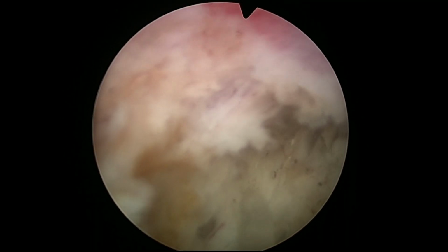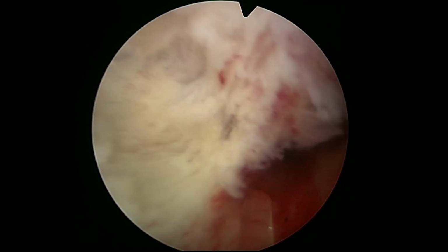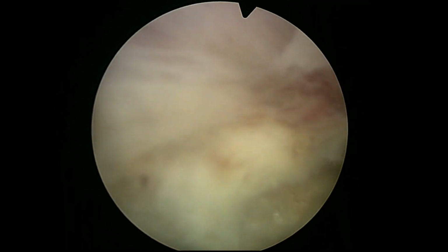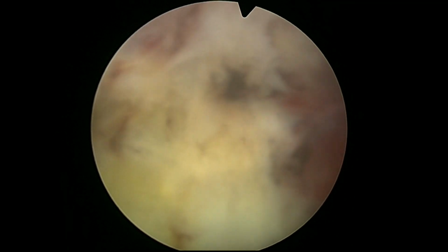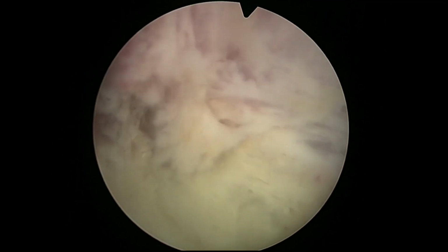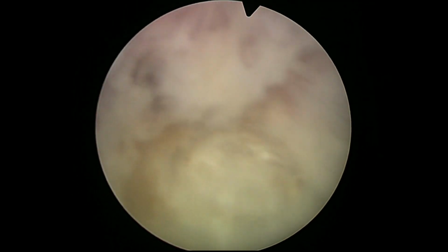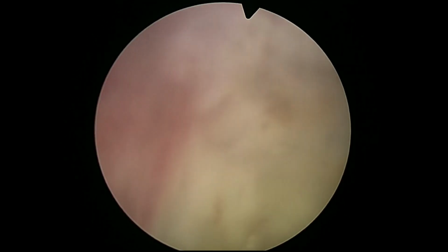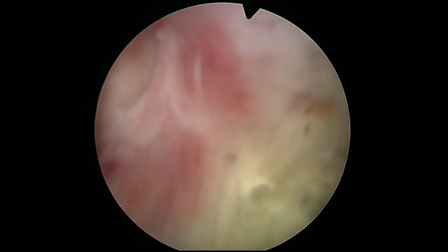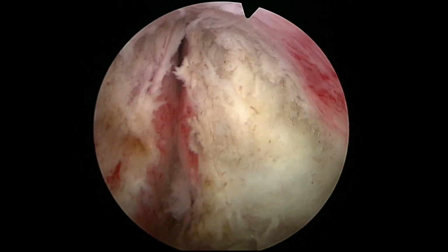To my liking, I think they do much better, and it is sometimes technically a little bit more difficult than the normal cases, because often we see areas of the prostate where the planes are obliterated by the tumoral tissue, by the cancer tissue, and it is a little bit difficult. You have to invent the plane a little bit. So it's again trying to do what you usually do with HoLEP, but in a difficult space.